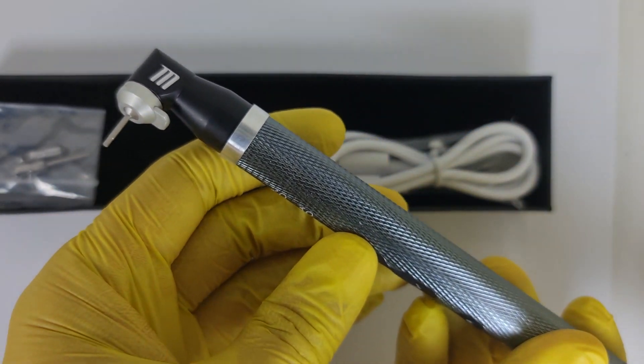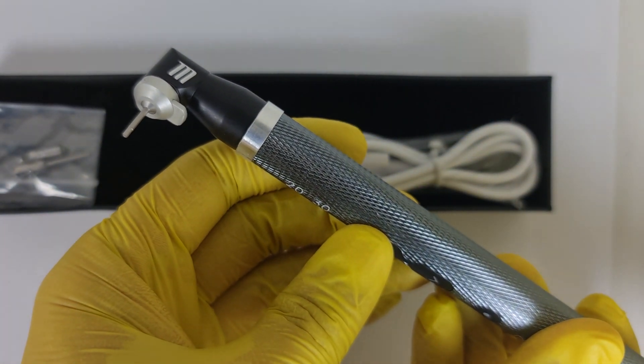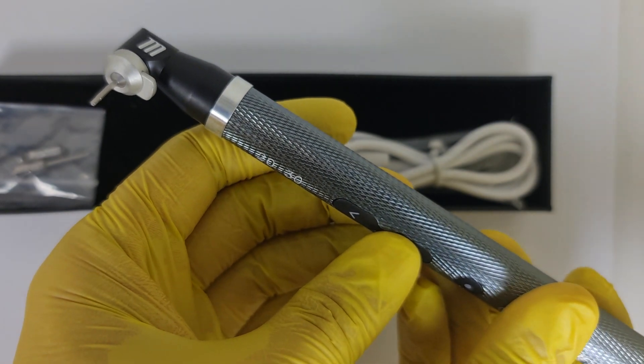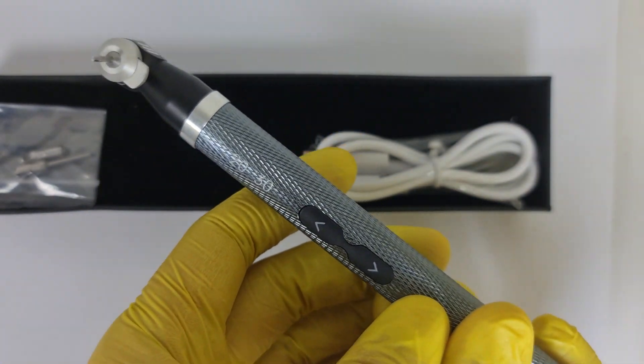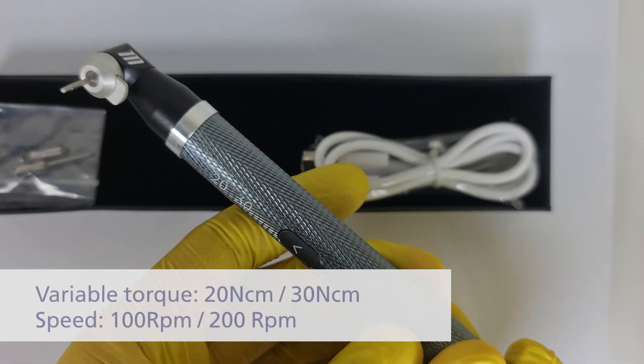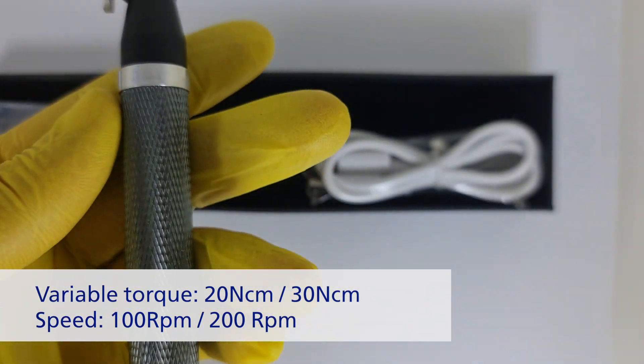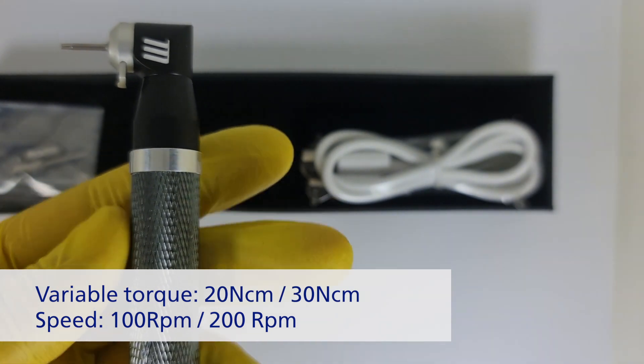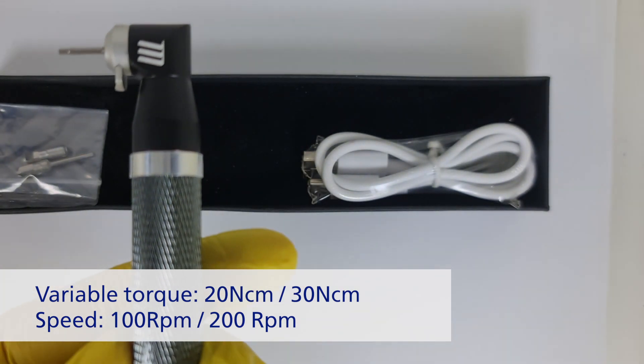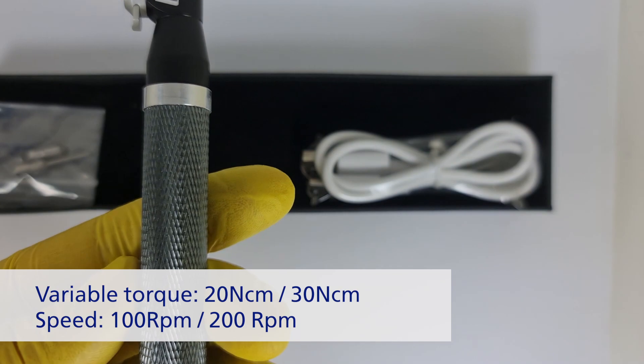What you have here is the same button for tightening and releasing the screw, but also there is a third button. Clicking on this button once and you will work on 20 newton centimeters. Clicking twice, you will be changed to 30, the maximum torque.